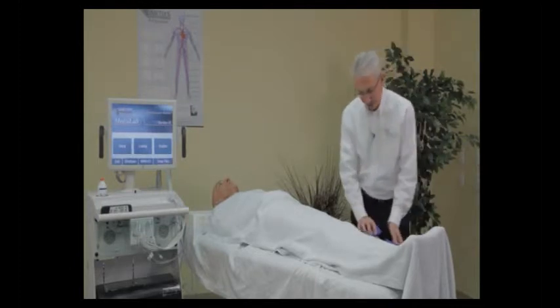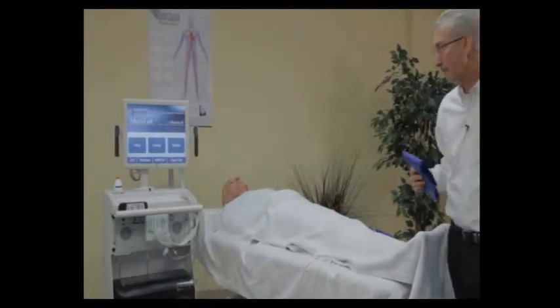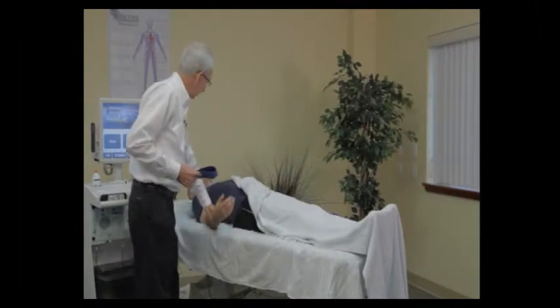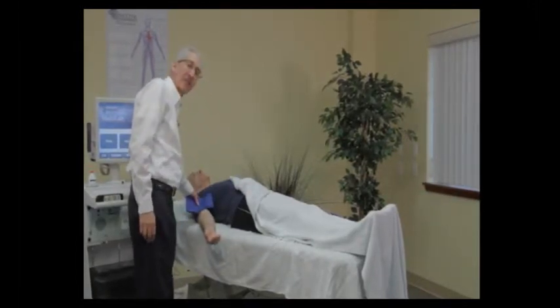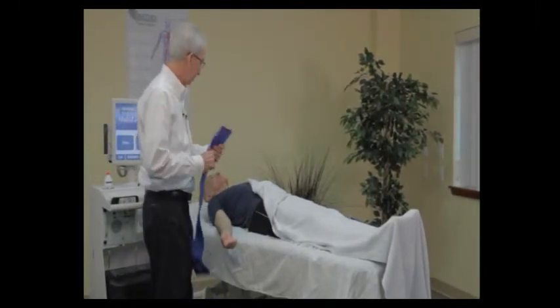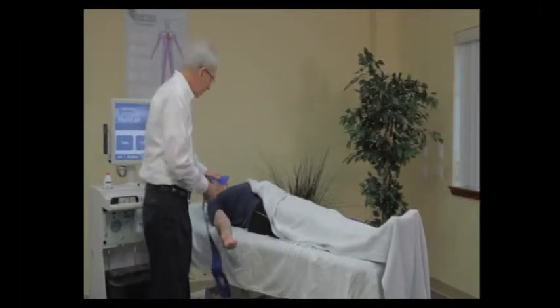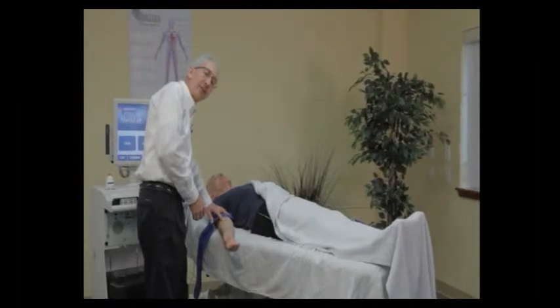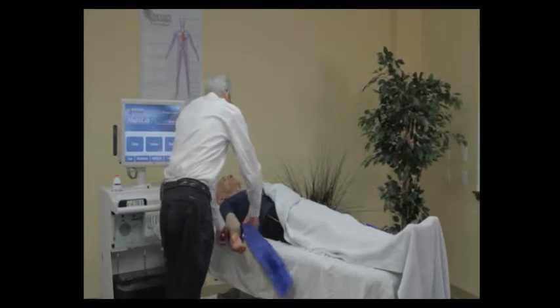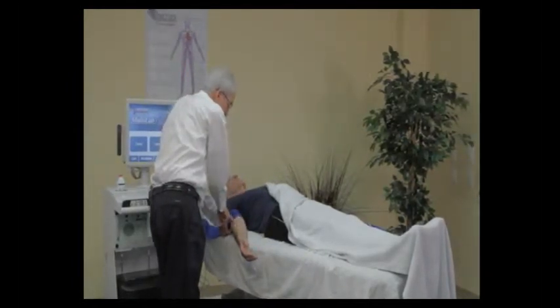Now I'm going to talk about placing the cuffs — do's and don'ts. Starting with the arms: you want to make sure the cuff is up above the crease comfortably, and hose position is extremely important. Typically we're going to be taking our Doppler measurement from the brachial artery, so if you position the hose near the crease you're going to be fighting it with your Doppler probe. I like to position the cuff inlet hose externally, leaving myself plenty of room to the crease in the arm.